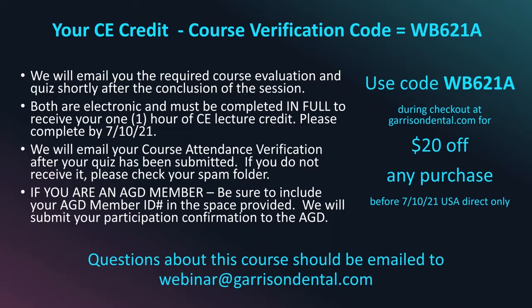If I'm really trying to bulk it out, I would consider something like a BioClear. That in my mind is where it shines, is really bulking teeth out, even subgingivally. That system does really well for that. The fusion system, like I showed today, doesn't really bulk stuff out in a non-natural way like sometimes we want to accomplish. So, that's a situation where we prep it if we're trying to create that unnatural contour where we're trying to close down space and really bring that restoration out towards the other tooth. We have to find a matrix system capable of doing that, and that's a huge challenge. I think that it would be a situation where I might pull out the BioClear system.